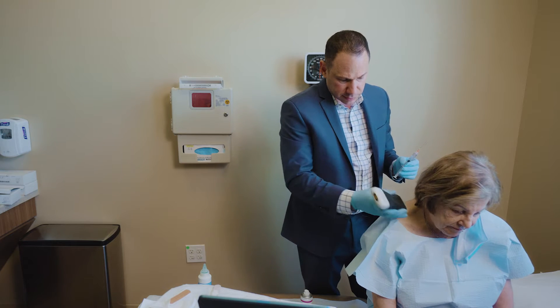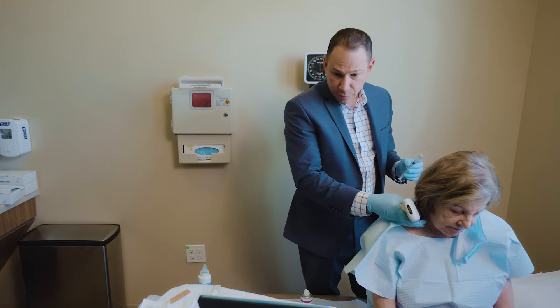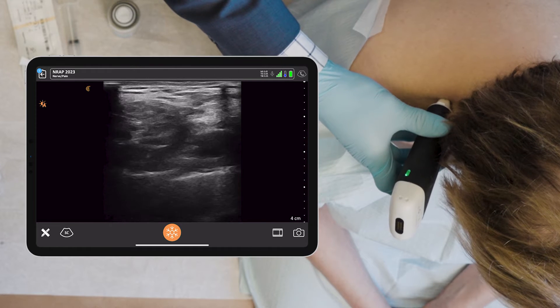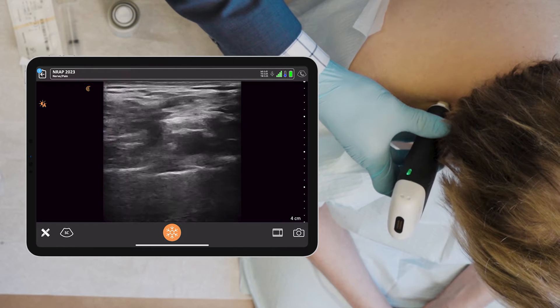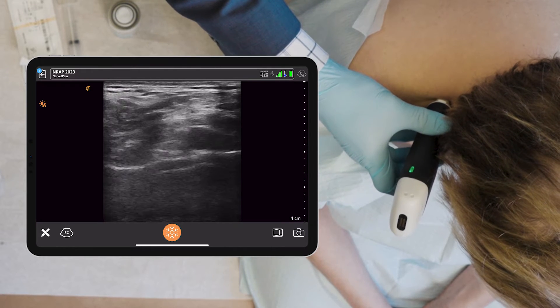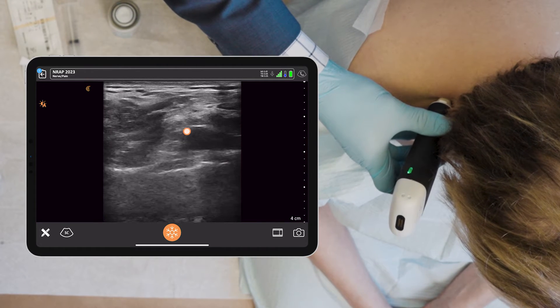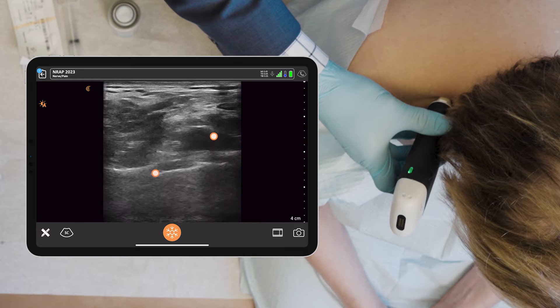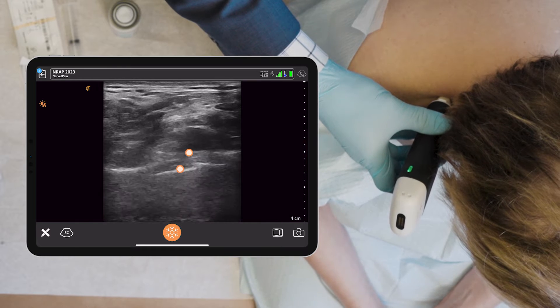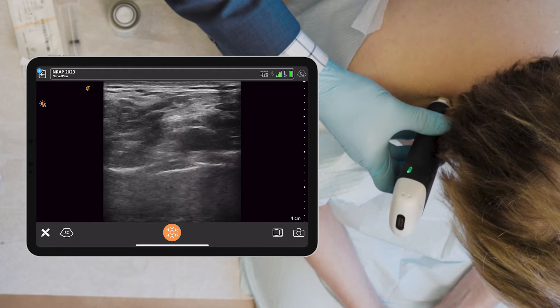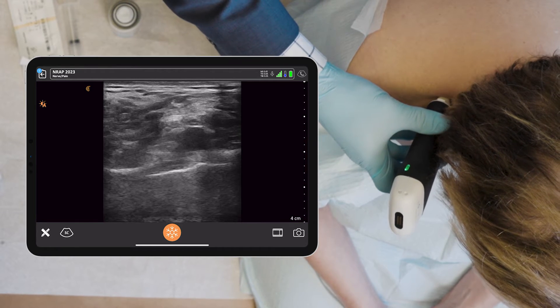I'm first going to scan her brachial plexus at the supraclavicular fossa and I see the subclavian artery and the first rib with the lungs below it. See the pulsating artery.